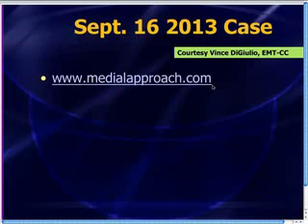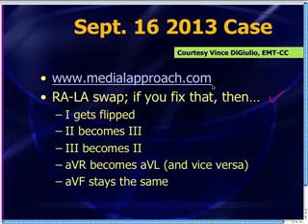So along to our rescue comes Vince DiGiulio, who is a pre-hospital care guru, and he has his own website with some great things on it. Check it out. And he said, you know what, there's probably right arm and left arm lead misplacement. And if you fix that, then there's a whole bunch of things that get fixed also. 1 gets flipped, 2 becomes 3, 3 becomes 2, AVR becomes AVL.